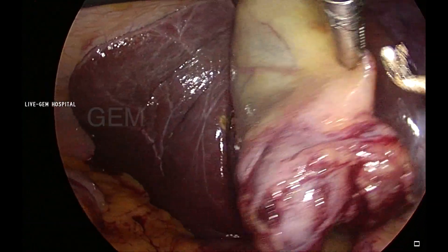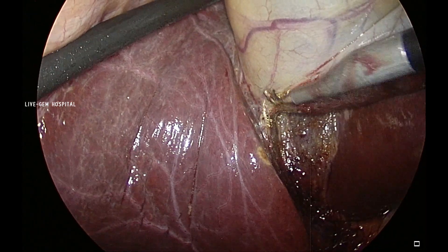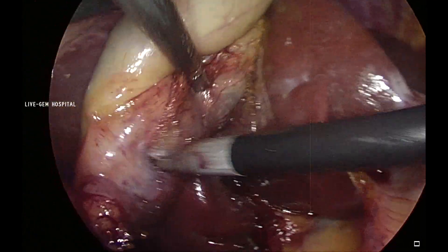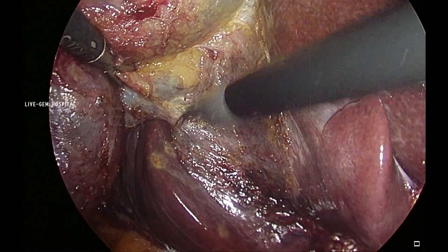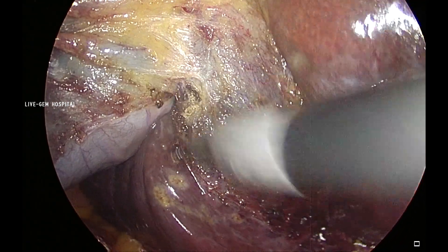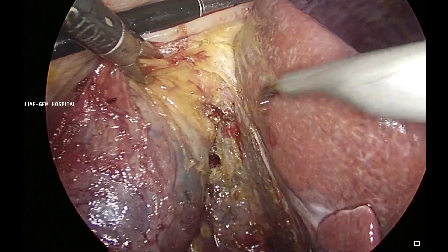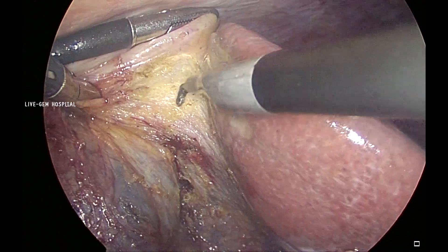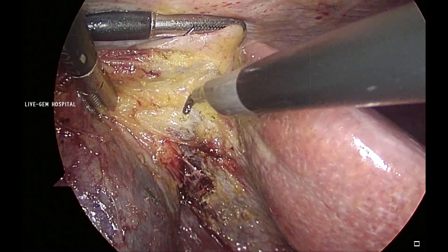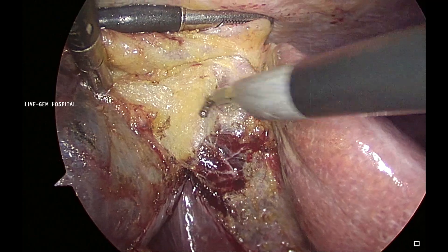See I am touching the gallbladder, now coming on the right side. This is like cooking only — I cook the peritoneum and divide. For the entire GB removal I am using the shoulder of the hook, not the tip. Any laparoscopic surgery uses the two-handed technique, and surgeons who use the left hand effectively and smoothly with coordinated deployment — that is what we call it in suturing — the left hand is the active hand. Now going towards the fundus — here the liver capsule is a little bit damaged, so I go back a little and come to the correct plane.